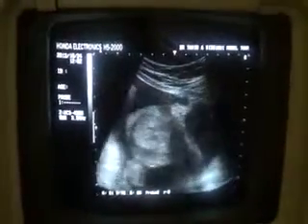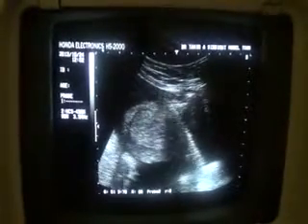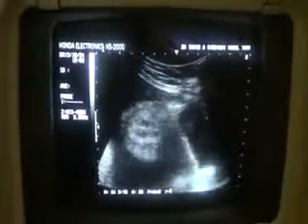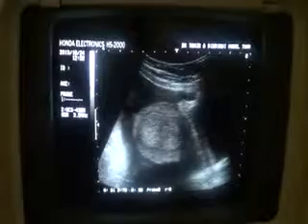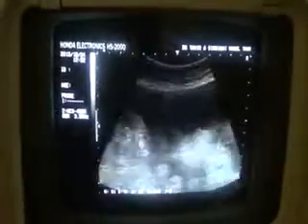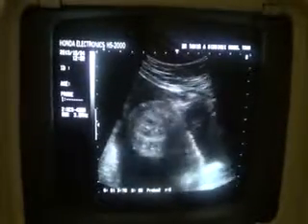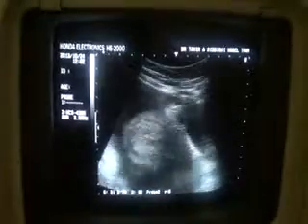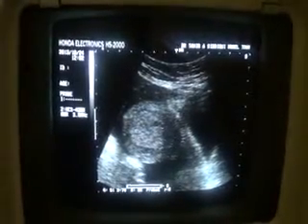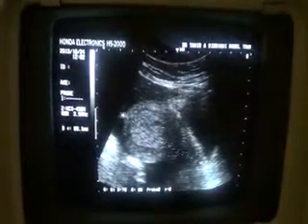For a postmenopausal uterus, it is unusual for the myometrium to appear without calcifications. With the pressure of the ascitic fluid, at times it becomes difficult to measure the size from transabdominal ultrasound.